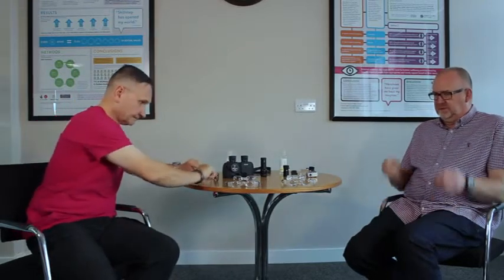you've got the clip-ons. The difference is the detail ones are for up close. The TV ones were always for distance or watching. Watching, I think, watching birds in the garden. Yeah, I think you used to be able to get one that was for sport, for further away, right. But I can't remember. It seems to ring a bell somewhere. Okay. But the problem with the glasses, you can't get your refraction on them. Right. So you could probably try those TV ones, Mark, and you could probably use the dials on.